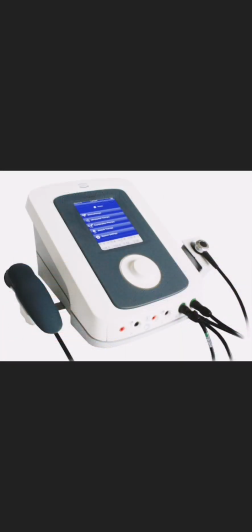Physiological effects of ultrasound. Thermal effects. Continuous mode US of 0.5 to 3 W/cm2. Those effects of ultrasound result from a temperature increase, 40 to 45 degrees centigrade, due to friction among molecules in the tissues. 1 degree Celsius increases metabolic rate. 2–3 degrees Celsius reduces pain and spasm and increases blood flow. 4 degrees Celsius increases tissue extensibility and decreases joint stiffness.